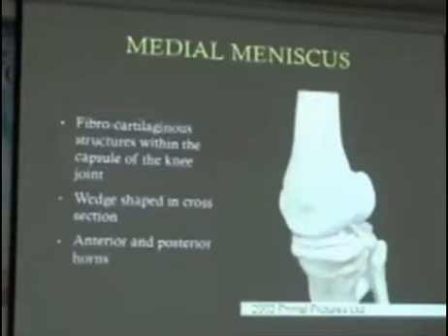And unfortunately, with ultrasound, we're really only able to see the superficial aspect of the meniscus.